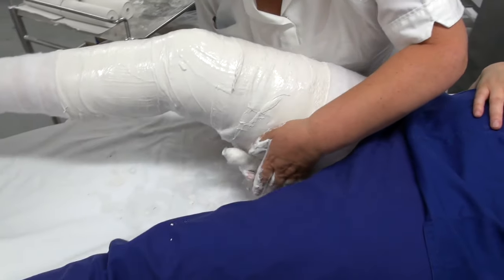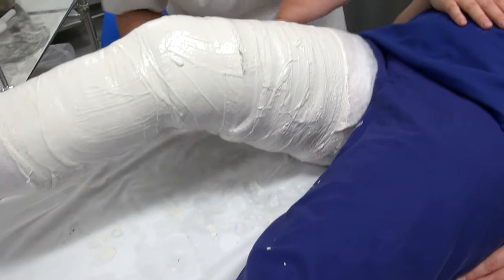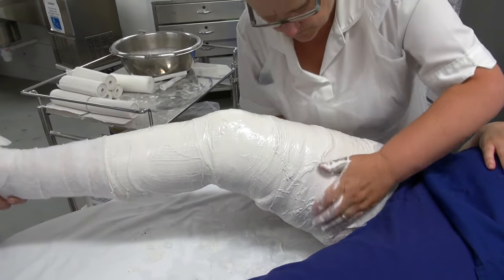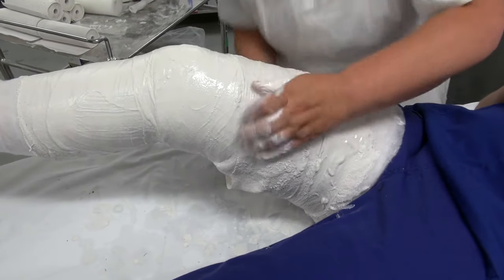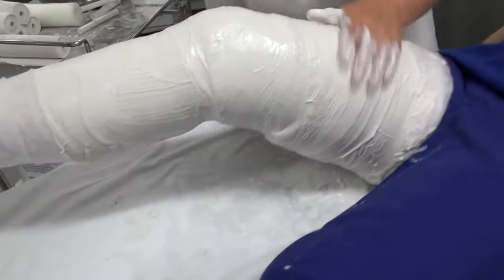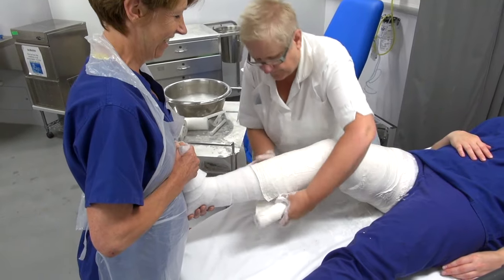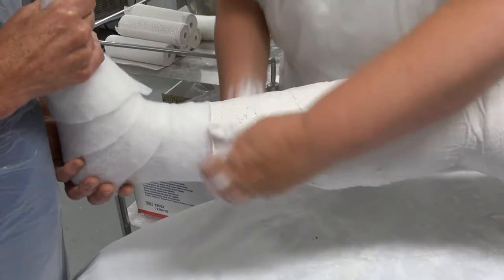Now Pam's working her way up to the top of the leg covering the thigh area, and then working her way down the leg towards the ankle.